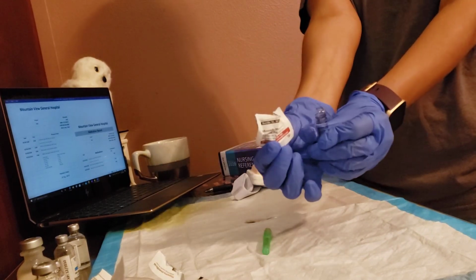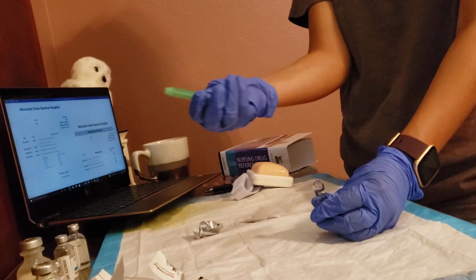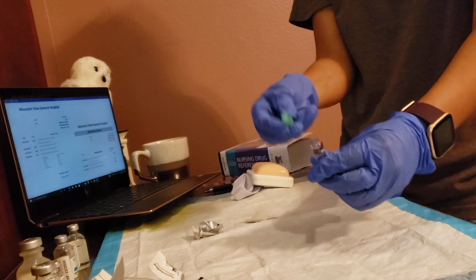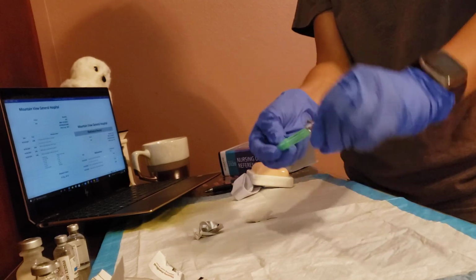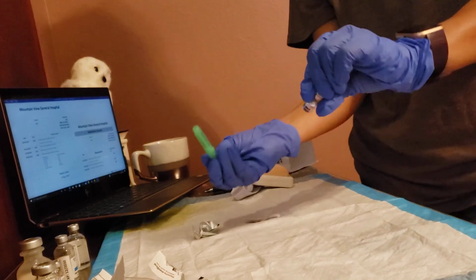And as you can see, it's opened, and I would grab my meds with a syringe and a filter needle. I would insert my filter needle and turn right around and pull it out like that. And that's it.